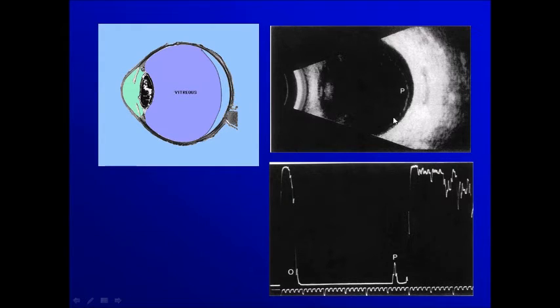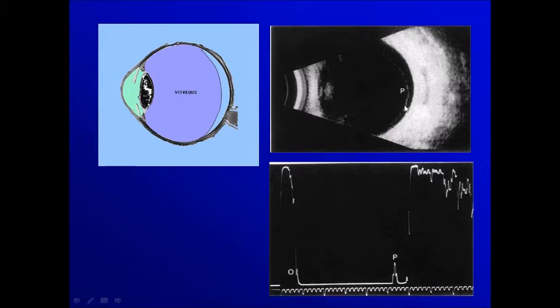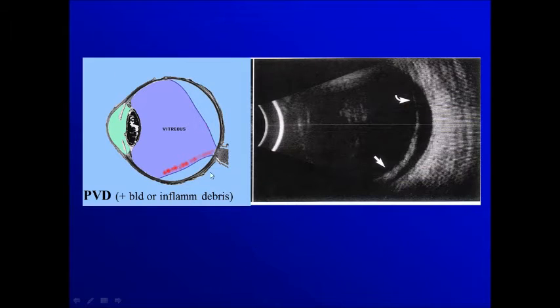If you notice here, we get a posterior vitreous detachment, and if you see the echo here compared to the 100%, it's much lower. We get zero percent here and 100 percent there — either the initial reflection or the scleral walls. On the B-scan you can tell that this line is not that bright as the background, so we get the same impression that this reflection is not that high. Sometimes if there is some blood, the possibility of detachment, the posterior vitreous will be more demarcated and the reflection will be more prominent.